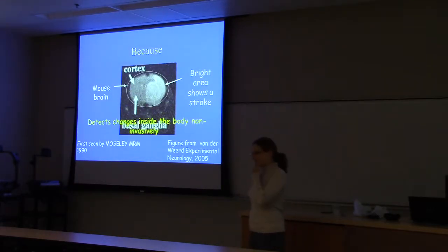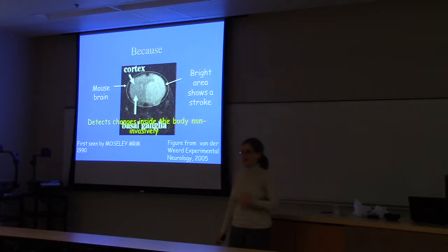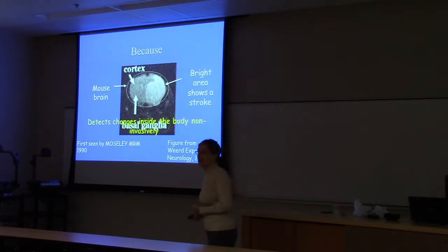So the reason we use MRI, despite all these hardships, is that we can see inside of the body without actually having to do anything to the body. It's all non-invasive. The mice I have to put to sleep, but you guys don't. I don't necessarily have to use contrast agents. It's all in there.